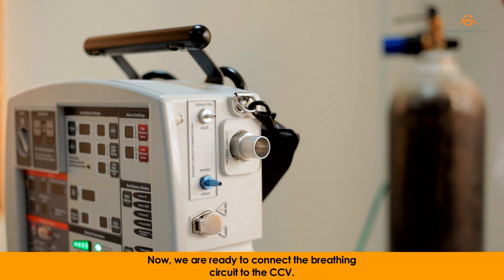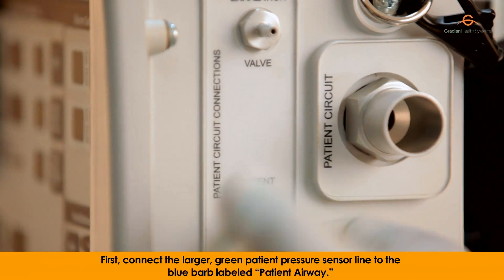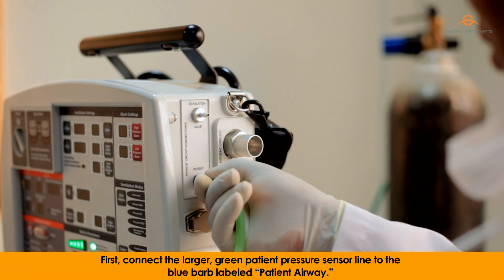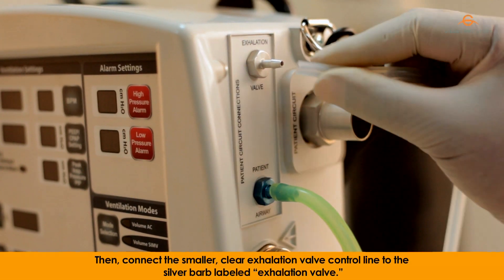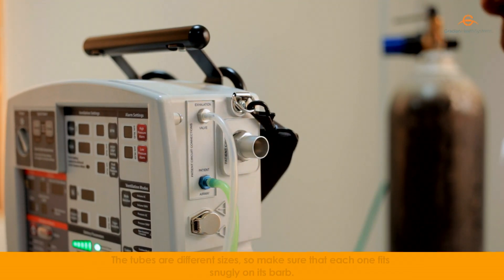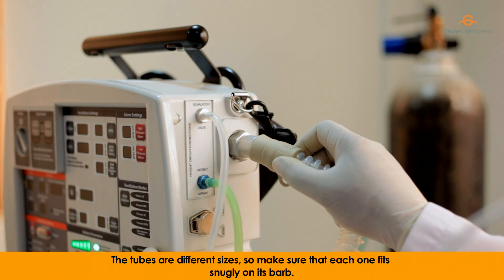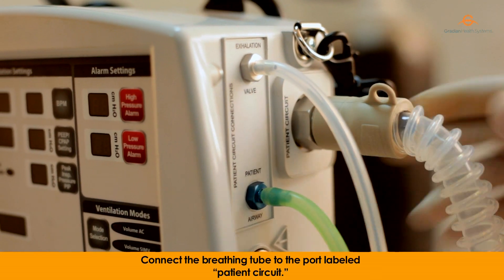Now, we are ready to connect the breathing circuit to the CCV. First, connect the larger green patient pressure sensor line to the blue barb labeled patient airway. Then, connect the smaller, clear exhalation valve control line to the silver barb labeled exhalation valve. The tubes are different sizes, so make sure that each one fits snugly on its barb. Connect the breathing tube to the port labeled patient circuit.